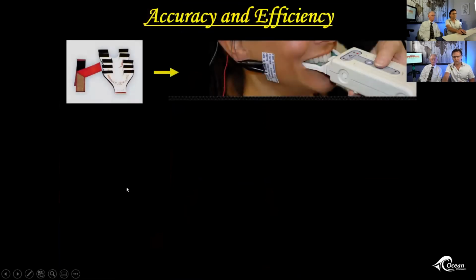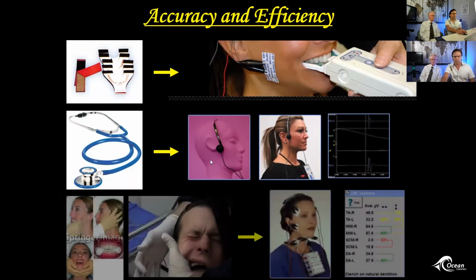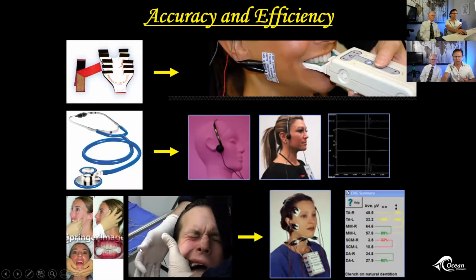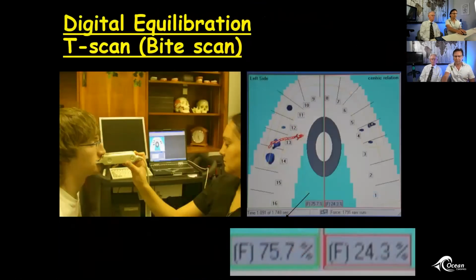Accuracy and efficiency. So we can dial in bites with articulating paper, or we can T-scan. We can check jaw joint health for an evaluation with a stethoscope, or we can use a joint vibration analysis from BioResearch. We can evaluate muscle health with palpation, or we can use EMG readings from BioResearch. Digital equilibration, T-scanning. We can actually dial in forces from one quadrant to another. Is it 75% or 25% here? The goal is to maybe get 50-50. That would be the gold standard, if possible.